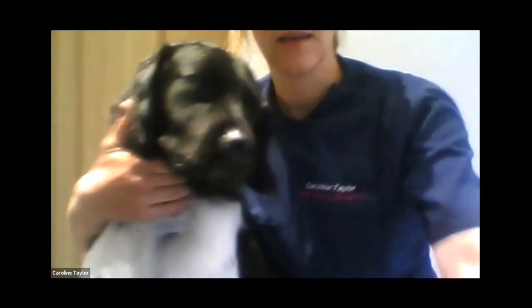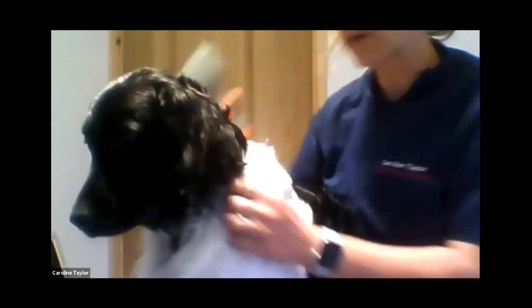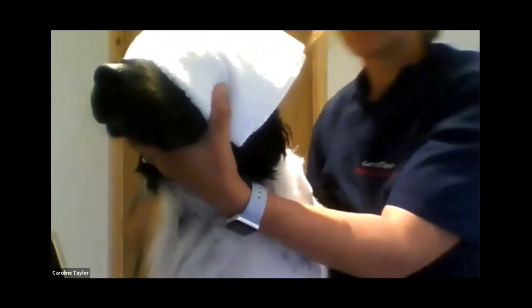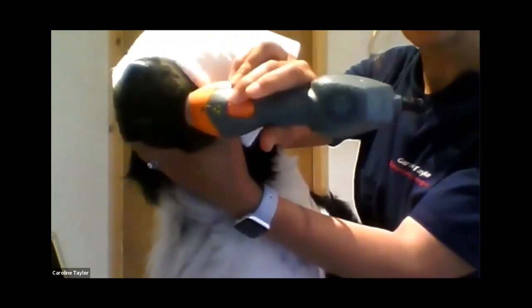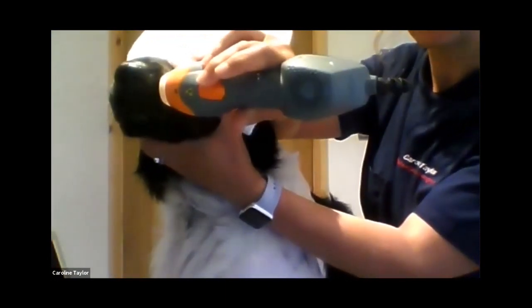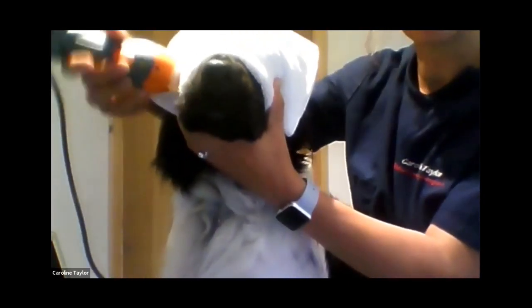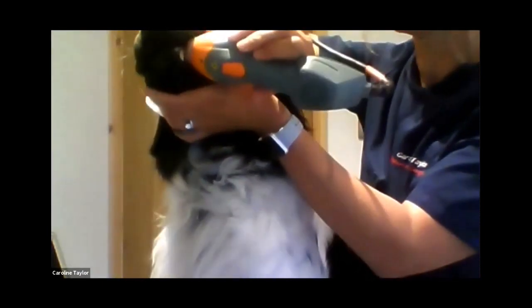So this is Merlin here. Normally what I would do is press the button to start delivering laser. I don't have any goggles here today, so with Merlin, I'm just going to cover his eyes like that. You can either start with treatment outside of the mouth like this, back and forth. You could do 2 points on the top jaw on each side and then 1 point lower down, but you tend to have to use a higher level, so go up to 50% if you're doing it through the skin.